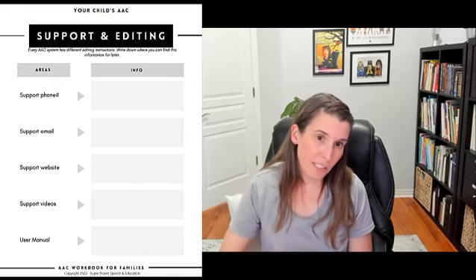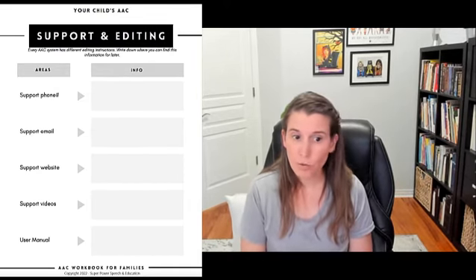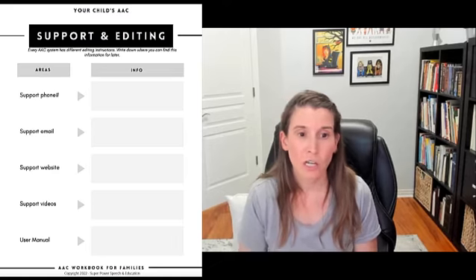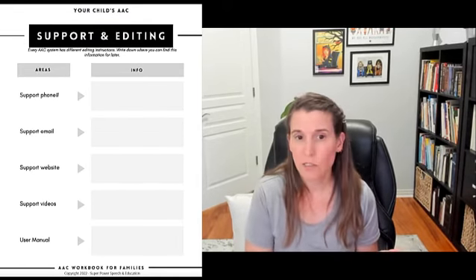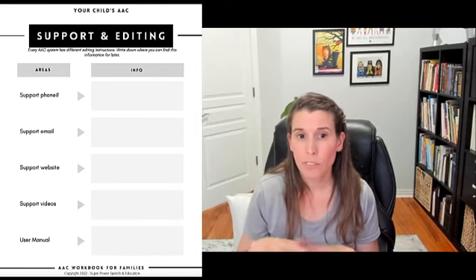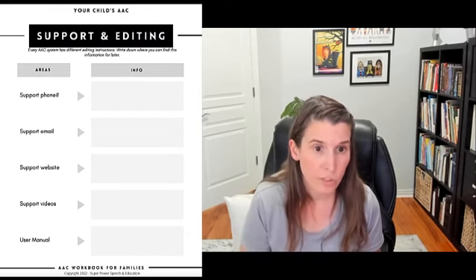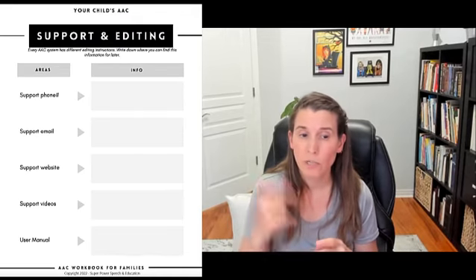Now, this is important as well. If your child has a high-tech device and you know that you're going to sometimes need some help with it, this is where you're going to do some Googling to get some information. What's the support phone number? If you are using a PRC or Saltillo device, then you can go onto their website and find their phone number and write it down. Please note that some of these companies have support in more than just English. So if you really need support in a different language, write that down.